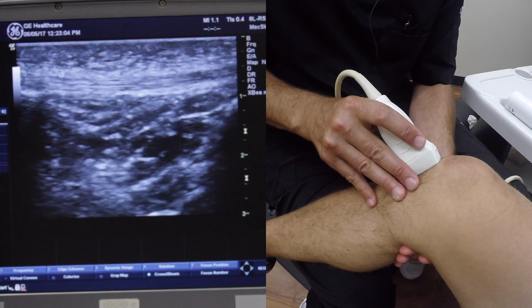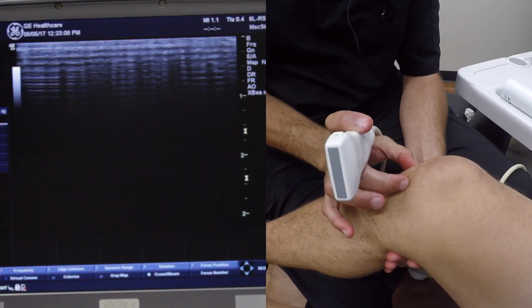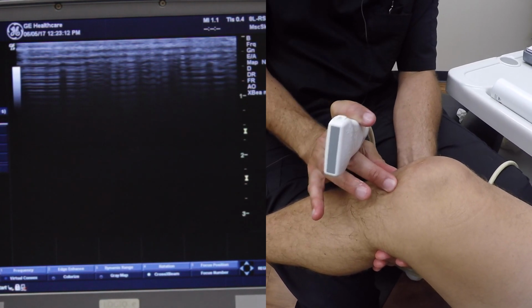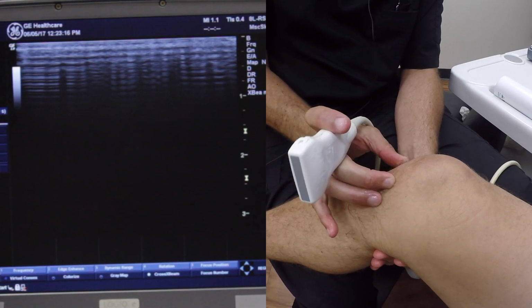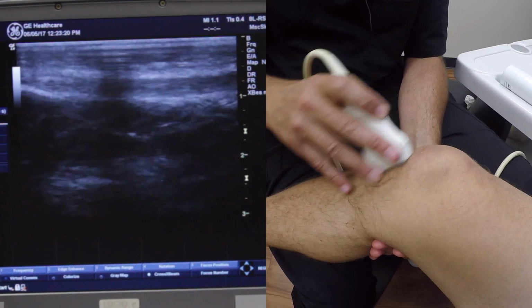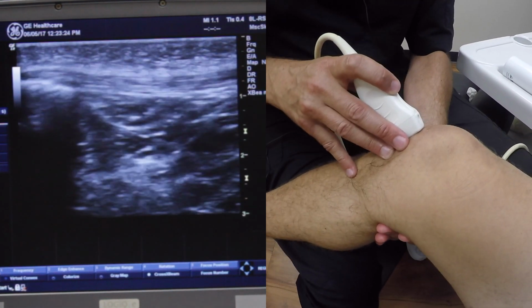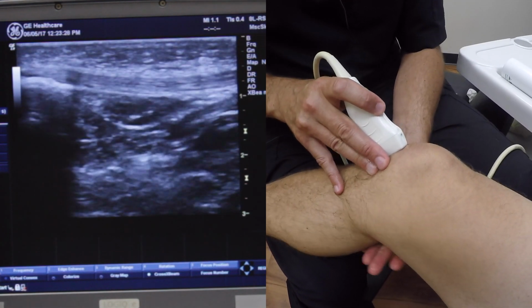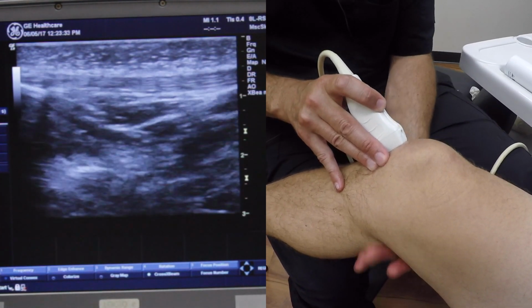Some of the things that we can see behind the patella become interesting because there's a fat pad called Hoffa's fat pad, and you can palpate it, it's right behind the patella. There is a condition where that fat pad becomes irritated and chronically inflamed, called fat pad syndrome, and it's a commonly misdiagnosed problem. Ultrasound gets a really good view of the fat pad, where you can see this mixed pattern of signal in there.